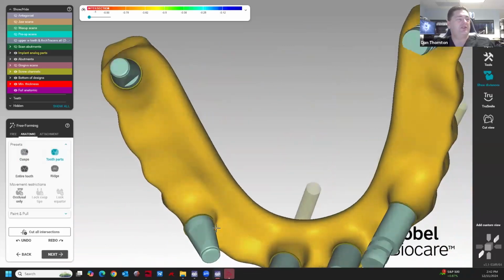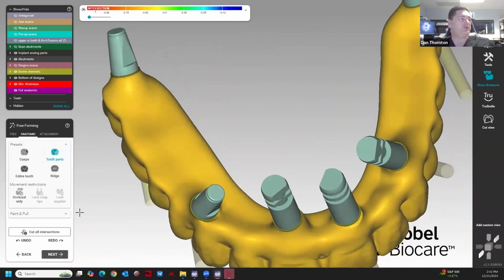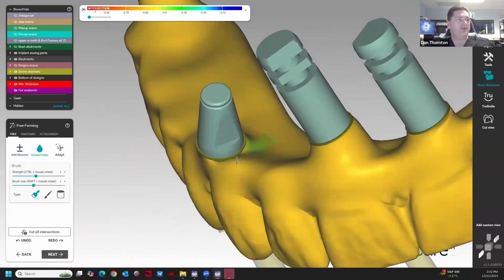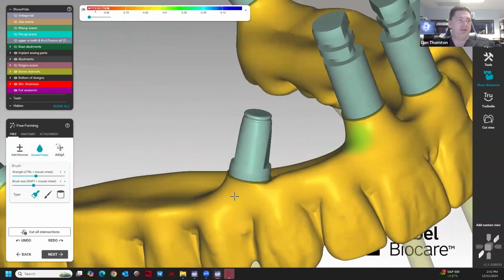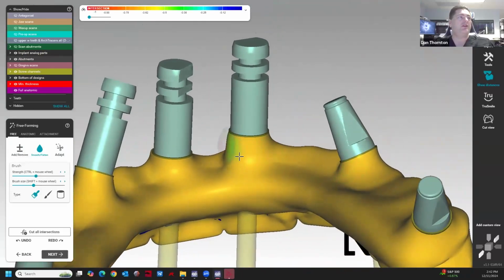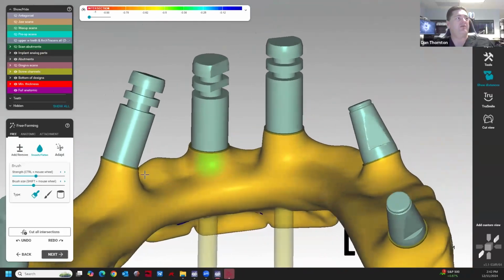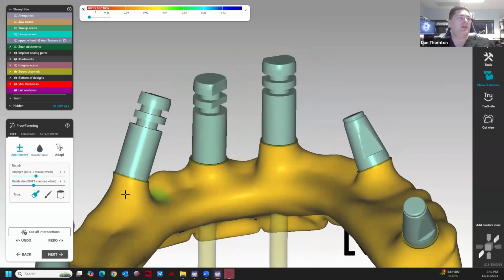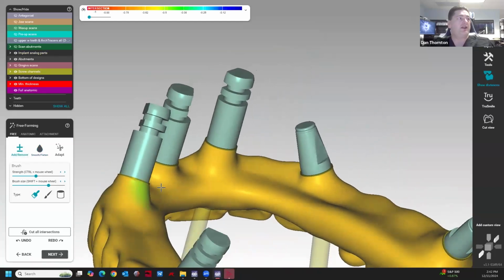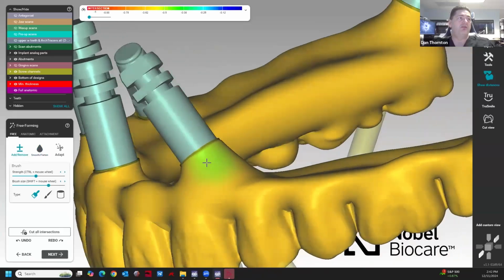Because you have to think about whether your material is going to handle the forces of the bite while they're healing. Do these break? Yes, you can have these break. The good news is we can turn these around pretty quickly. We can have another set printed in the same time frame. Some offices print two at the same time, so they already have a backup just in case.